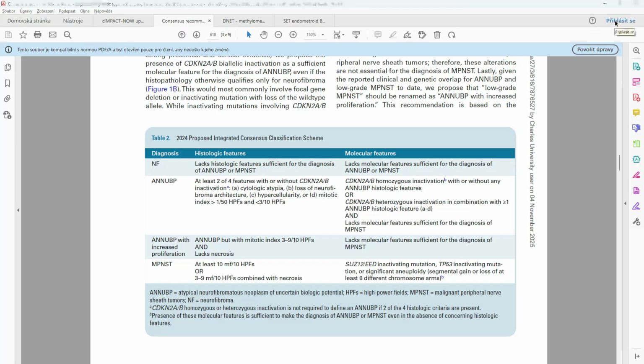Okay, so we'll move to my next case, and this is a historical case.